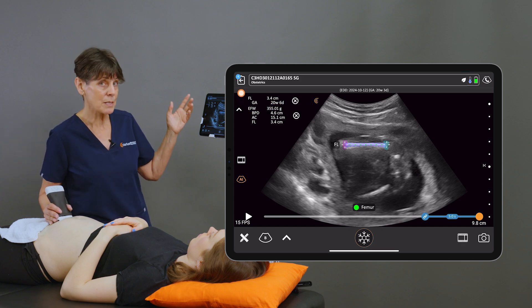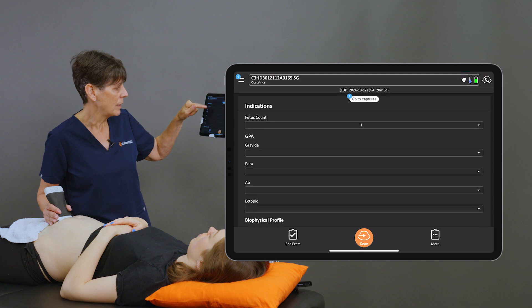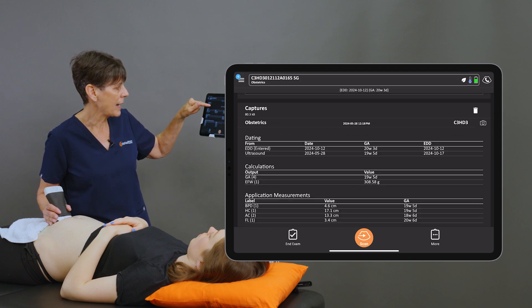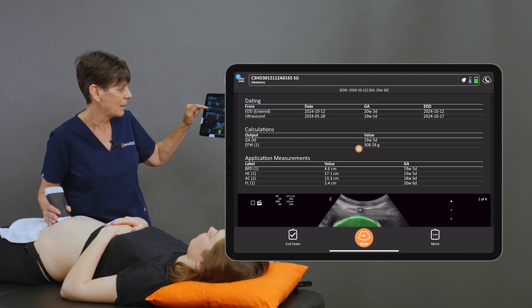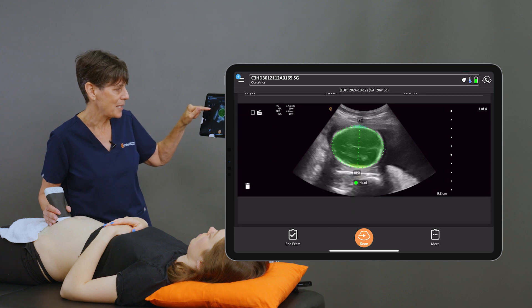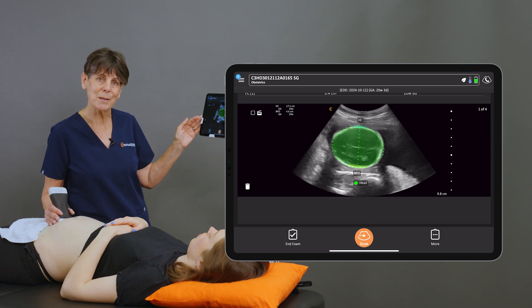Now at this point, once all our images are done, we can go back into the report page. This is where I can access the ultrasound gestational age, the estimated fetal weight, and all of my measurements and images. We can end our exam, and all of those images and numbers will be in the report.